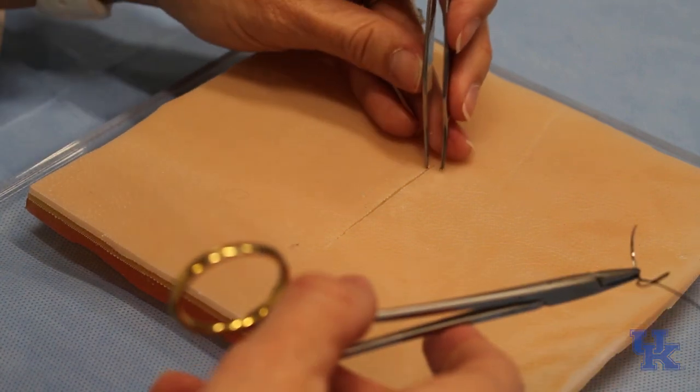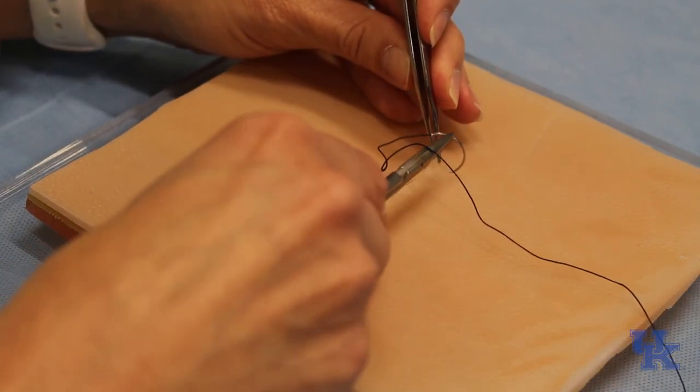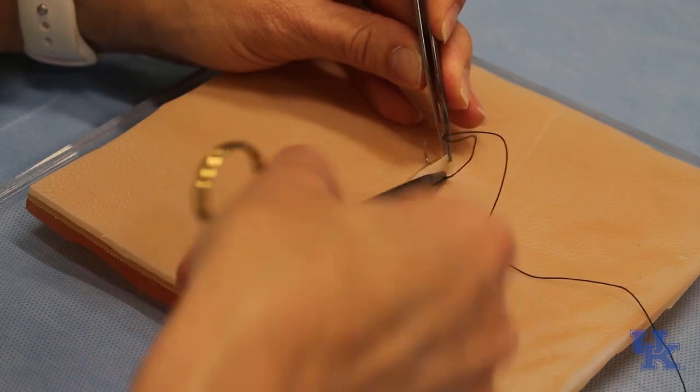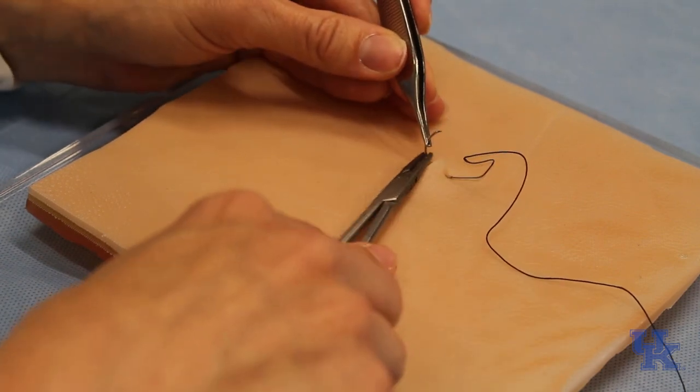I'm going to demonstrate a simple running suture. It's not difficult. You're going to start at 90 degrees, go in, you're going to throw a simple interrupted, same as we taught you initially.